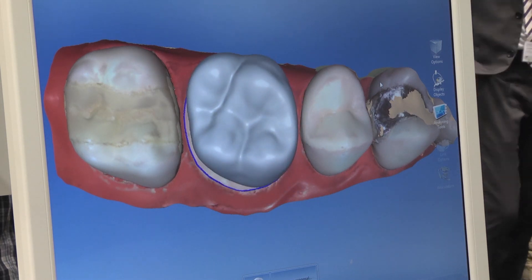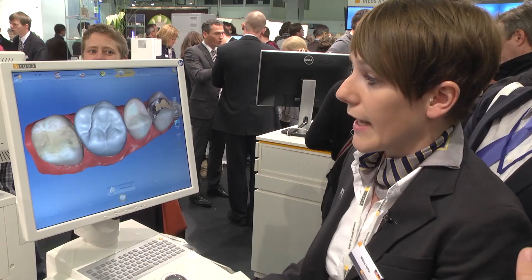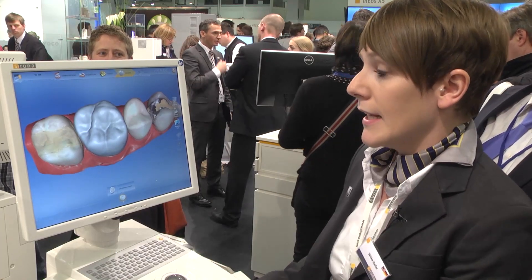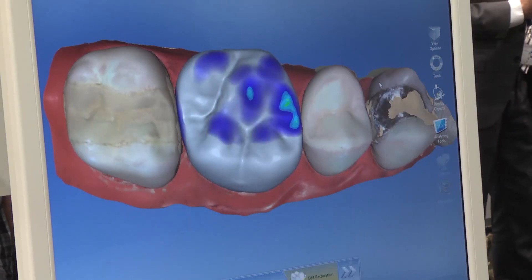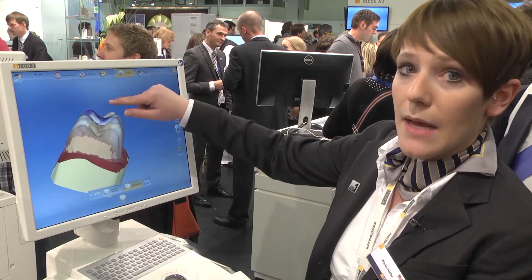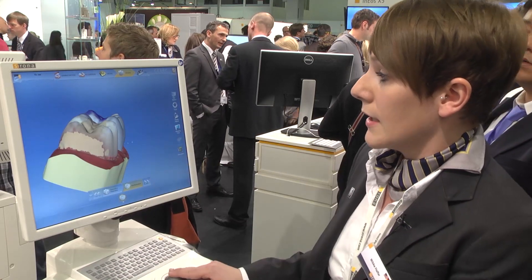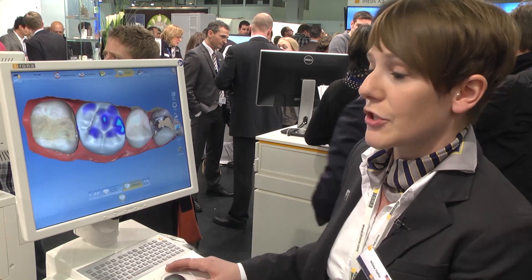Now we see the biogeneric proposal. Biogeneric is a tool where the software recognizes the surfaces of the neighboring teeth and generates a first proposal that matches them. You'll always get nearly the same surface characteristics — the depth of the fissures is consistent, and the buccal information is also incorporated. The great advantage is that you rarely need to make changes; the first proposal is nearly the best result you can get. That's the final crown, and now we can send it directly to the milling machine.